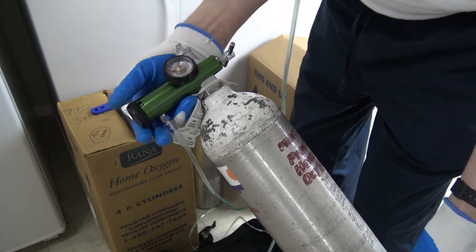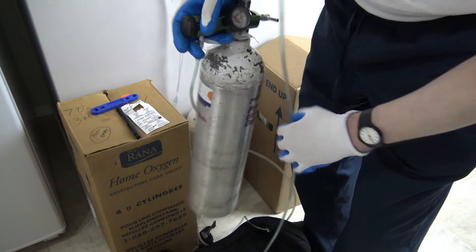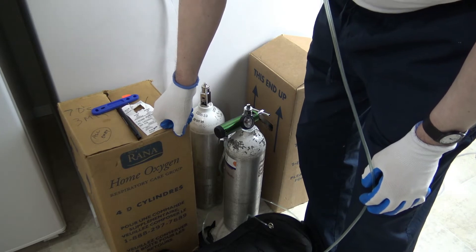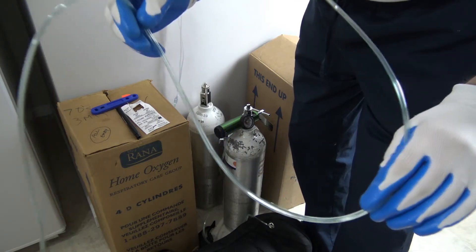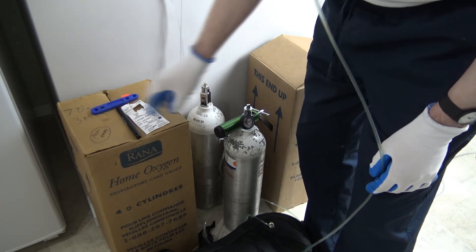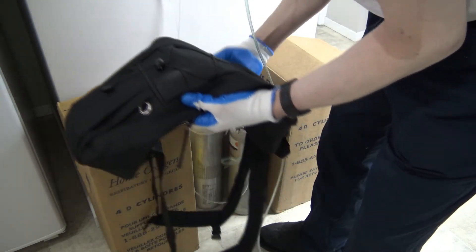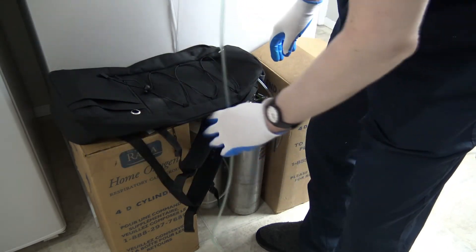That's my portable oxygen. I want to show you a bit about the complaints and problems I'm having with these tubes — they go around the ears and into the nose. Right now I've got 16 cylinders in stock. This one in the box is completely empty. Be careful — this is all highly flammable, so be very careful when you store these. They can't be stored in the heat.